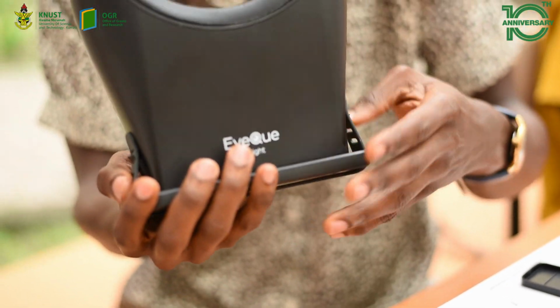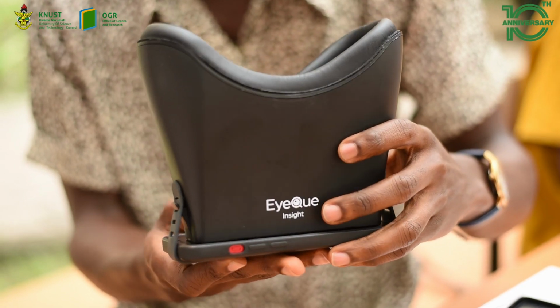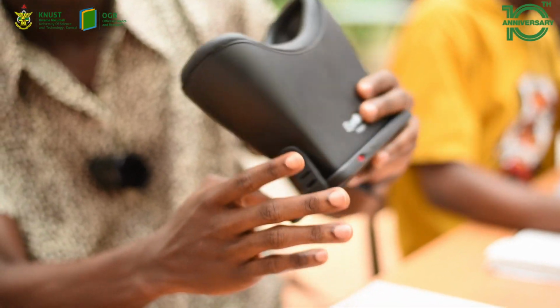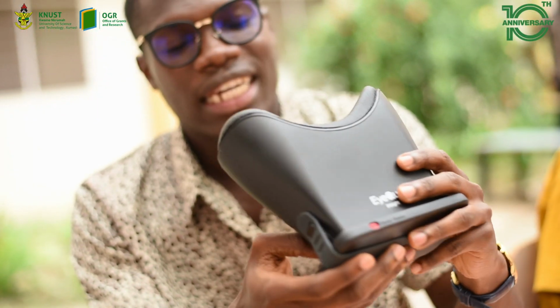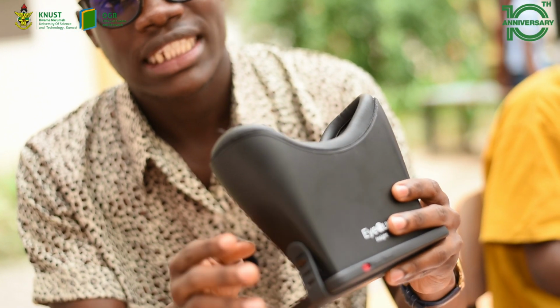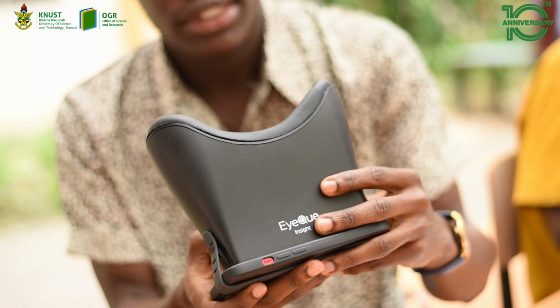Right, so it holds it in place, and then we can start. The patient looks through the eyepiece here, and as you look through, there are a series of targets in there that you swipe in the direction of. It works with the tumbling E optotypes, so you just swipe in the direction of each of the optotypes as you use it.